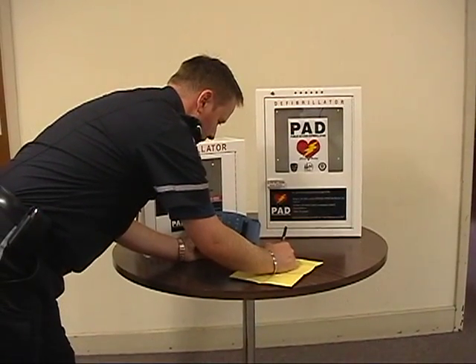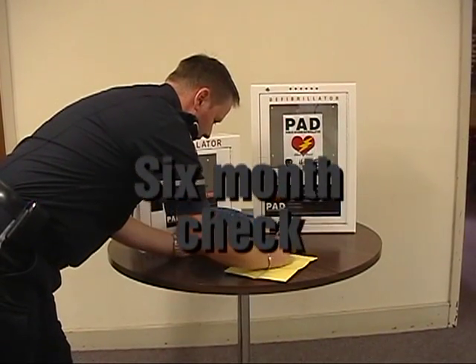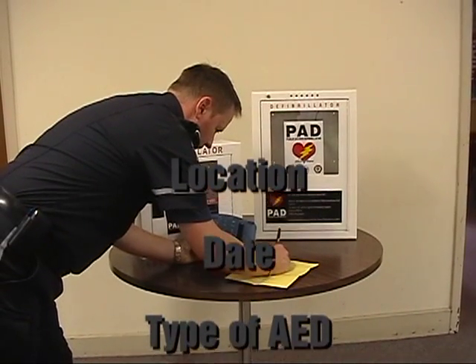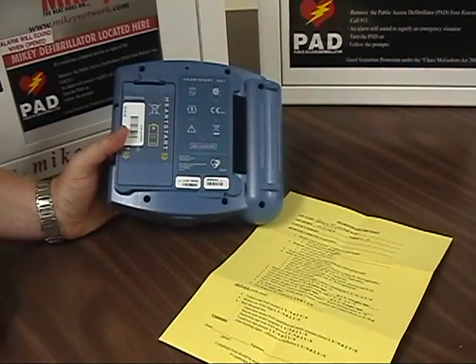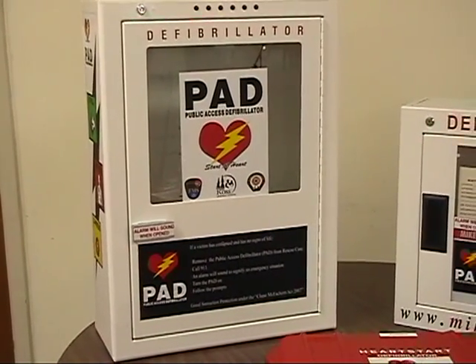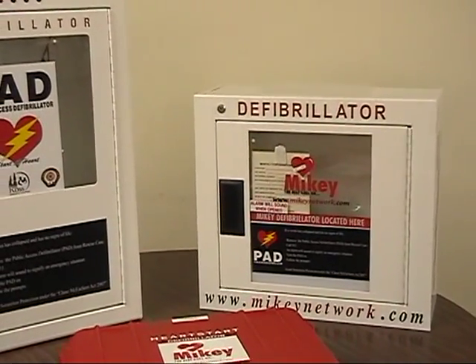We will now go through the steps of the six-month PAD check. The first step is to document your location, the date, the type of AED or public access defibrillator you have, the serial number which is found on the back of the defibrillator, and the contact person at your location. The rescue case type is either the large white box, the small white box, or the red mobile response case.